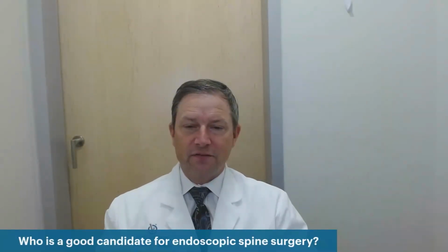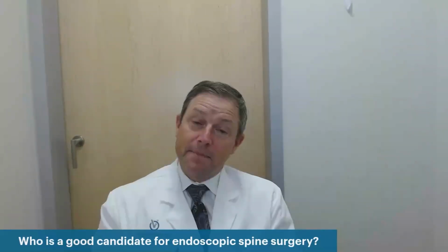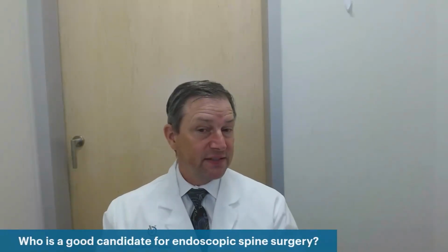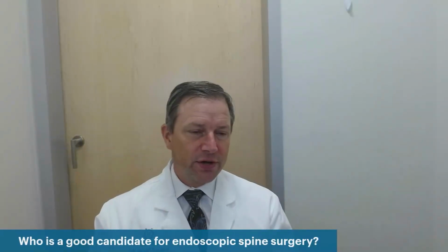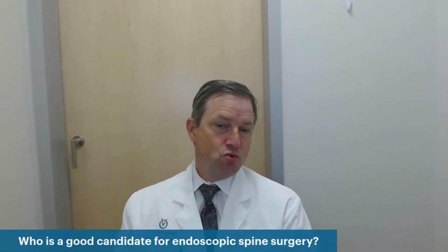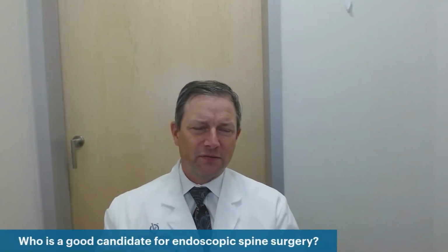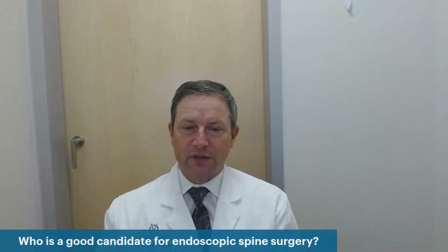Who is a good candidate for endoscopic spine surgery? Ooh, man, that's a good question. Well, I think patients that are trying to get back to an active lifestyle is one example. I used to be very hesitant about back surgery in someone in their 20s. But the truth is the endoscopic tools are so minimally invasive. If you've done some injections and you have a hot disc or a big disc, it's easy to pluck out or do a discectomy with that endoscope.